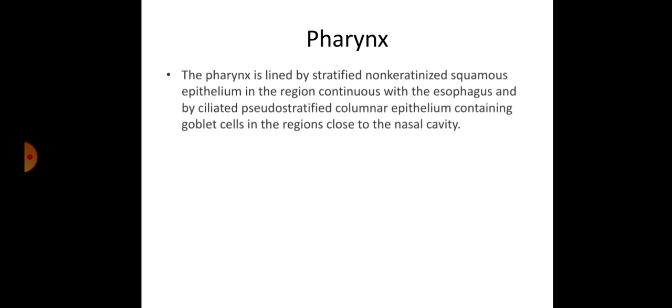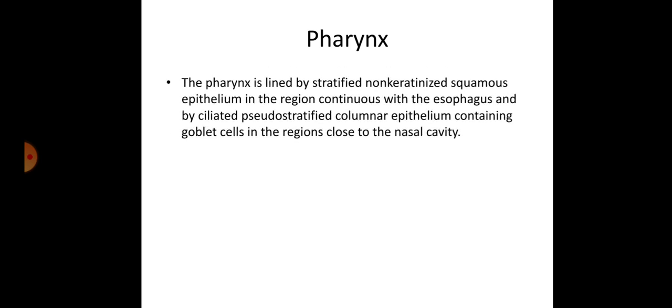Now, finished with the oral cavity, we move to the pharynx. The pharynx is also lined by stratified squamous epithelium, where it continues with the esophagus.